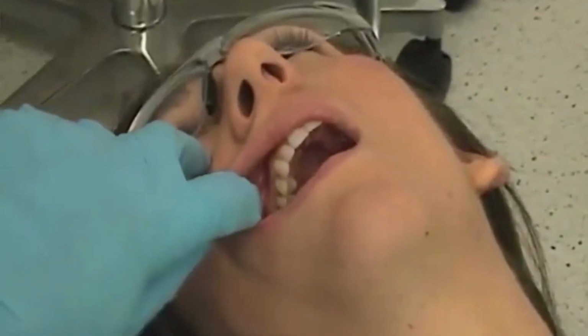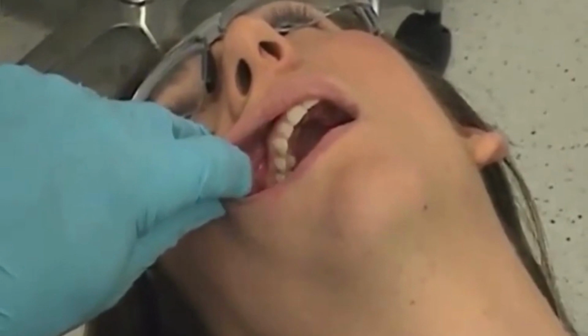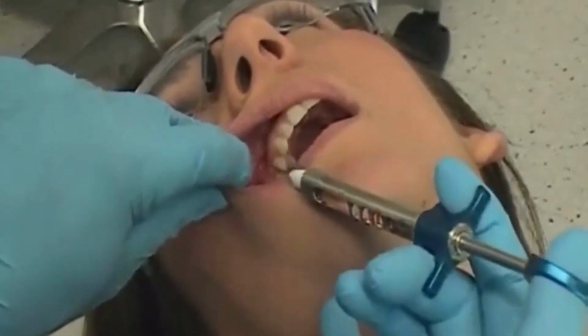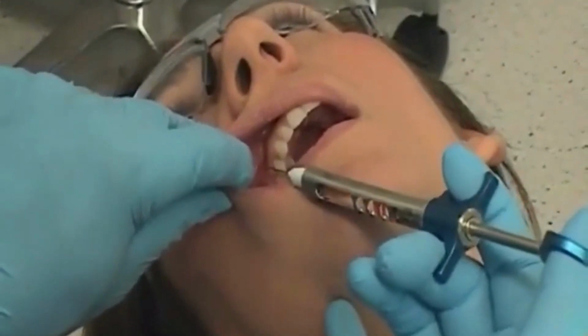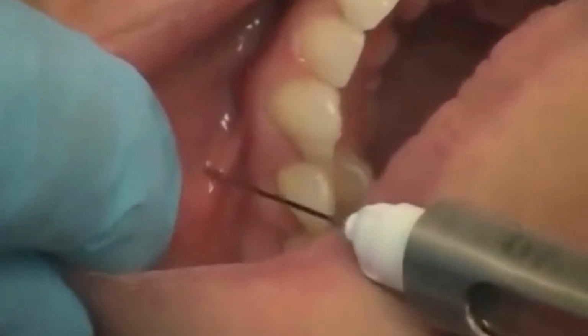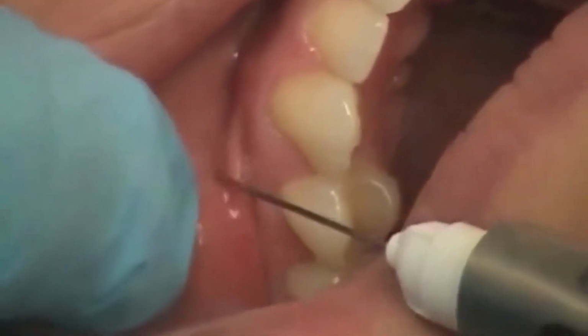Place the patient in a seated position so that the maxillary occlusal plane forms a 45-degree angle with the floor. Use a cotton-tipped applicator to apply a topical anesthetic to the oral mucosa of the gum line above the maxillary canine. Retract the cheek with the thumb of the non-injecting hand, and then insert the needle into the mucosa above the upper second bicuspid, approximately 0.5 cm from the buccal surface.